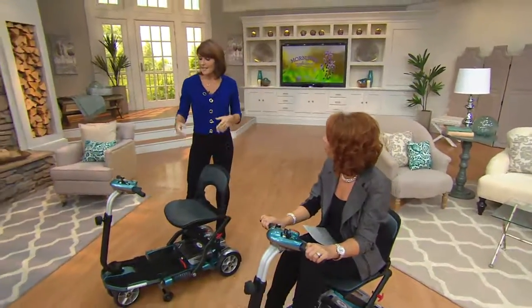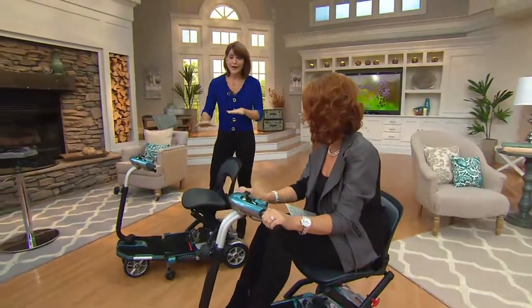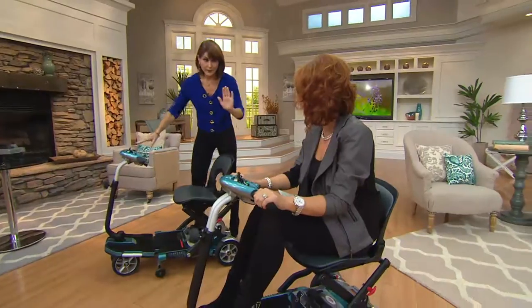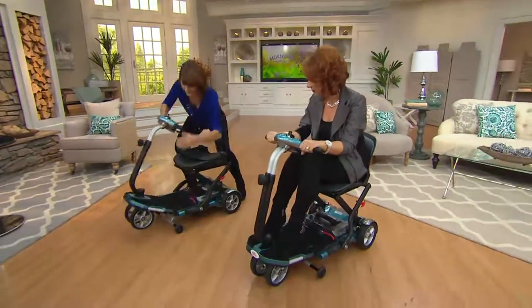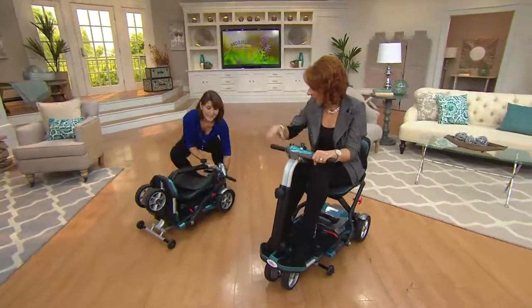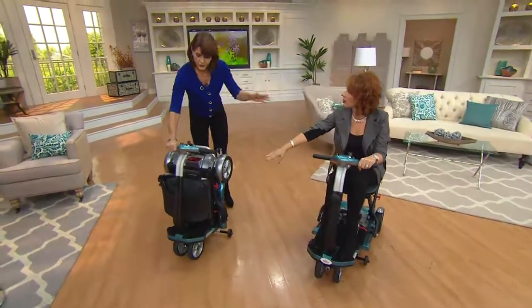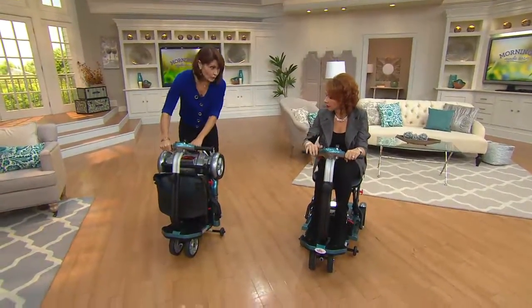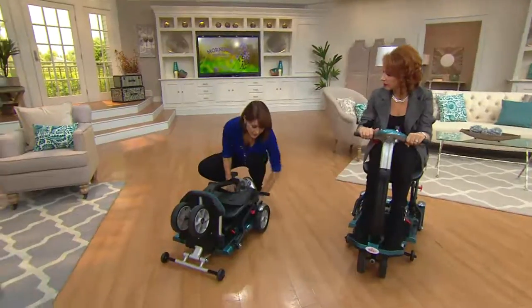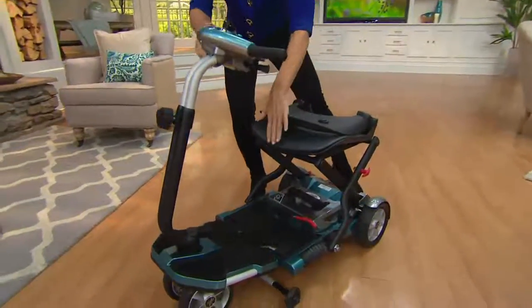What I like to say is the EV Rider is as easy as one, two, three. I'll show you how easily it folds and unfolds. Here's one, here's two, and there's three. That's how easily this unfolds and it lives in the back of a van, the trunk of your car, or if you use it in the home primarily, in a closet. To unfold it again, watch — one very important click because this locks it into place, two, and three.